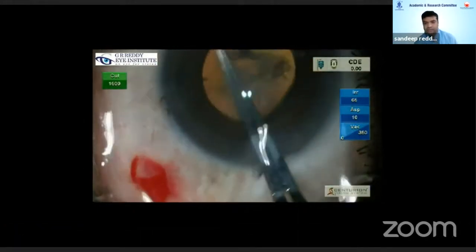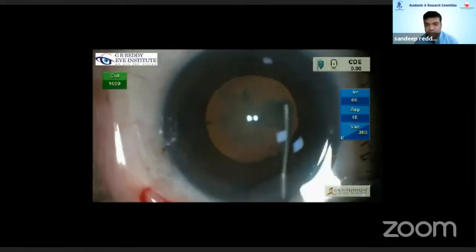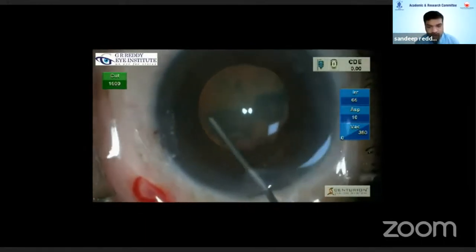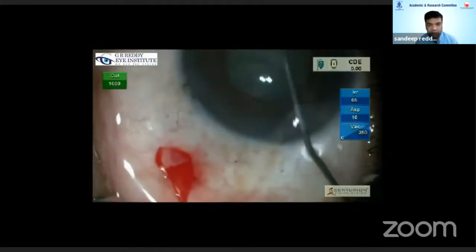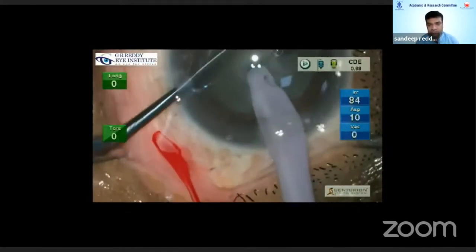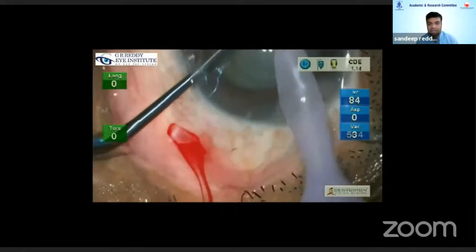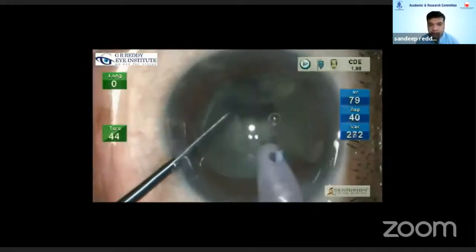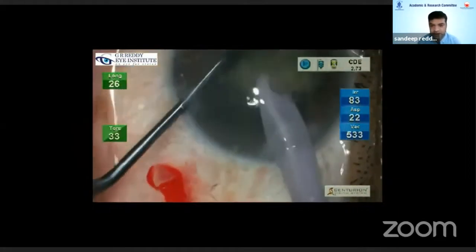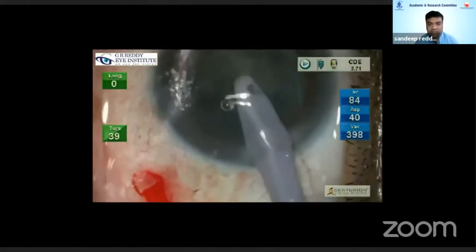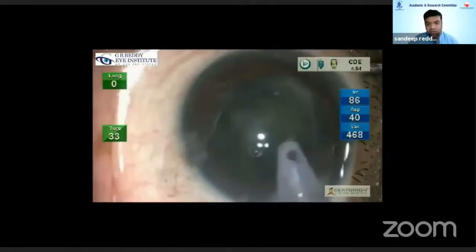What I observed is that when I was using a certain viscoelastic — HPMC from a certain company — I regularly encountered this kind of positive pressure. I realized that the viscoelastic I was injecting was sometimes getting through the zonules into the vitreous, and sudden hydration of the vitreous because of the viscoelastic was causing a sudden rise of IOP.